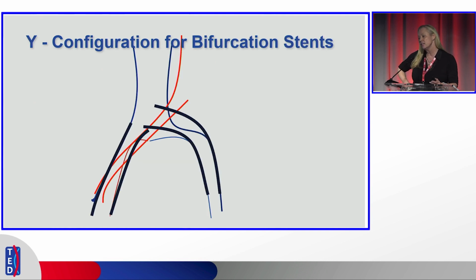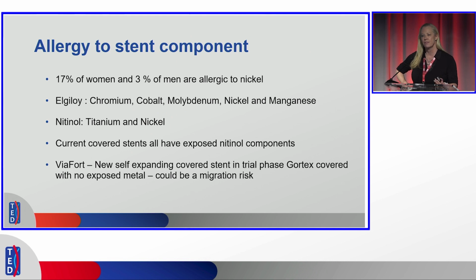So the technique that I use is that I usually stent the left iliac vein, and if the right needs to be stented, which it frequently does not after you've stented the left in non-thrombotic disease, you tuck the right-sided stent just up underneath it. But the problem is, if you stick that left stent out too far, you can still end up with altered flow dynamics there, and it's not perfect that way either. So I don't think we have the right stent or a right system for the bifurcation in non-thrombotic patients yet.